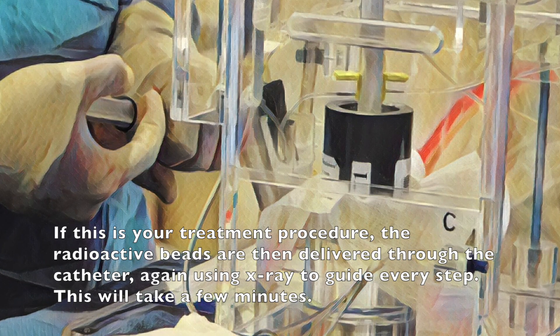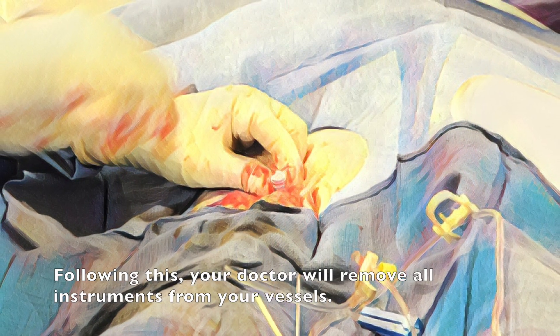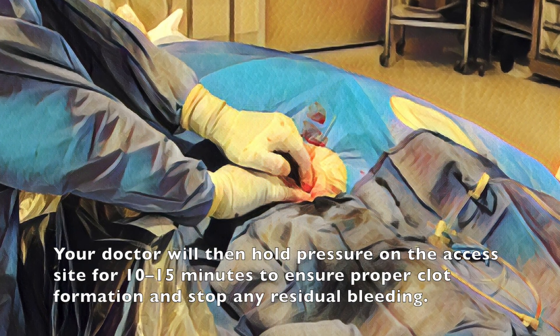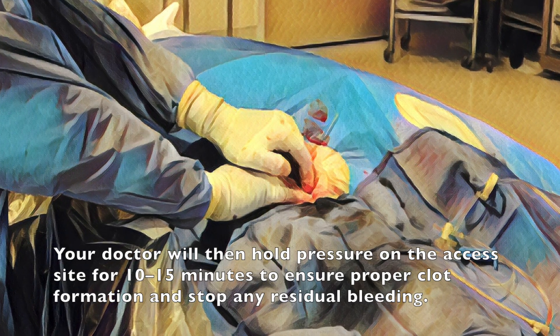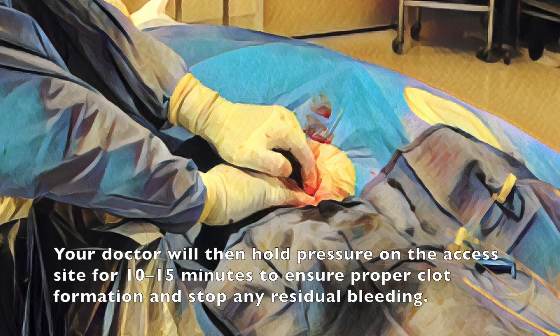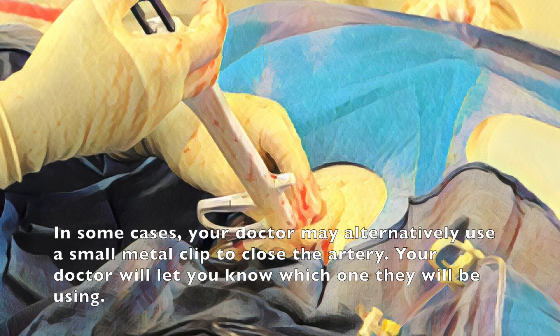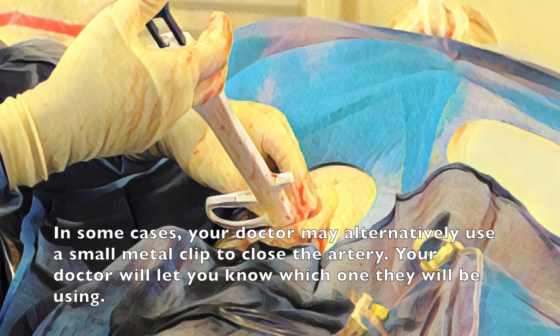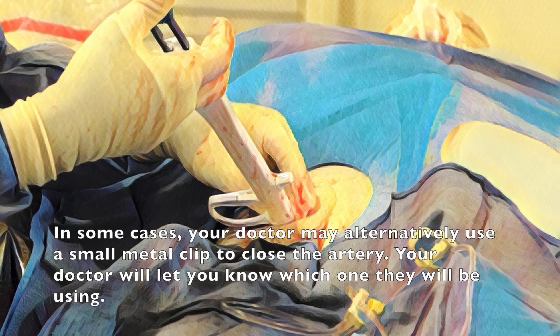This will take a few minutes. Following this your doctor will remove all instruments from your vessels. Your doctor will then hold pressure on the access site for 10 to 15 minutes to ensure proper clot formation and stop any residual bleeding. In some cases your doctor may alternatively use a small metal clip to close the artery. Your doctor will let you know which one they will be using.